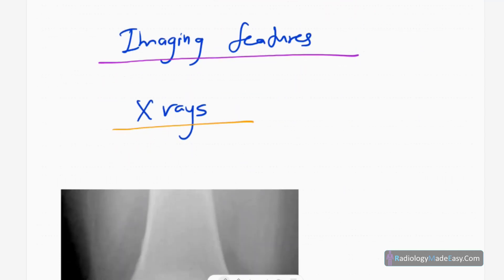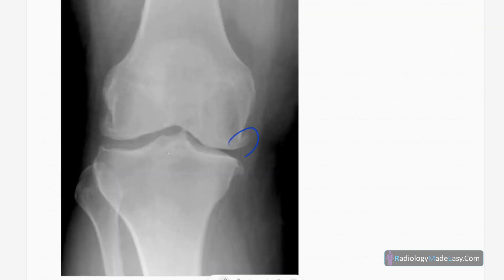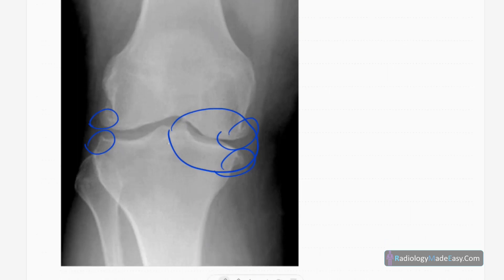Now let's look at the imaging findings, starting with X-rays. This is the anteroposterior radiograph of the knee joint in a skeletally mature patient — it's early disease. You can see marginal osteophyte formation in both the tibial and femoral articular surfaces. Mainly the early involvement is seen in the medial compartment. There is subtle joint space narrowing and osteophyte formation, with no subluxations and no subchondral sclerosis.